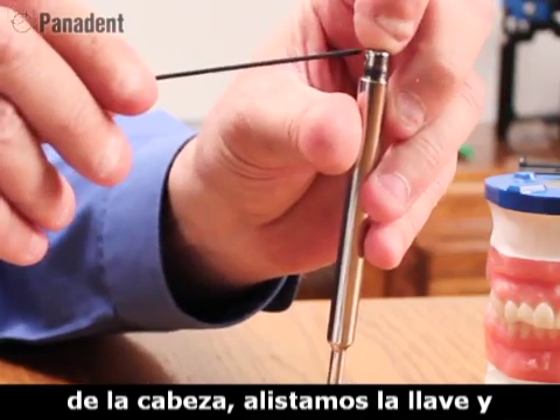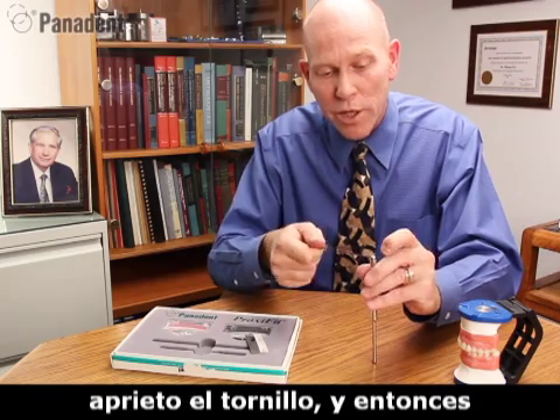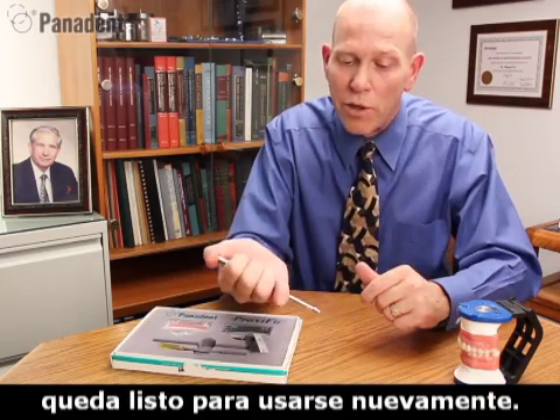Then we add the spring, and then we add the button head to it. I get the wrench ready, then I push down until I feel the plunger at the top of the button, and tighten the set screw. And now we're ready to go again.